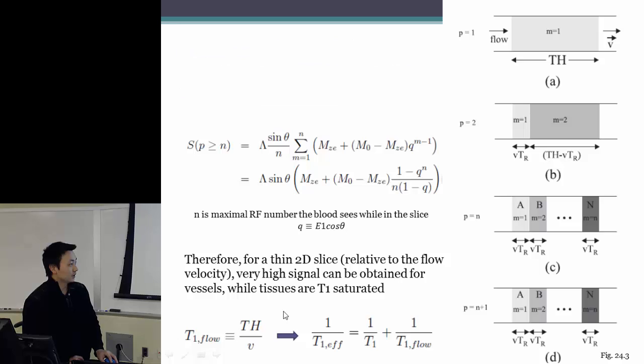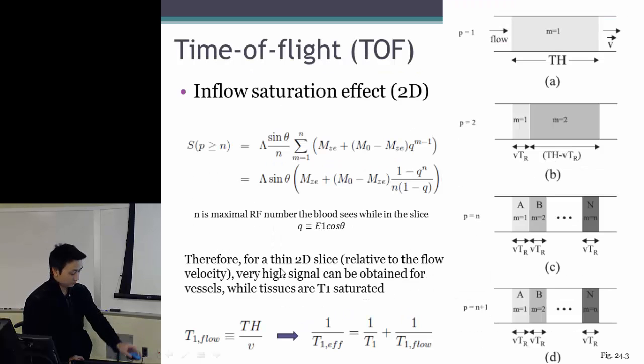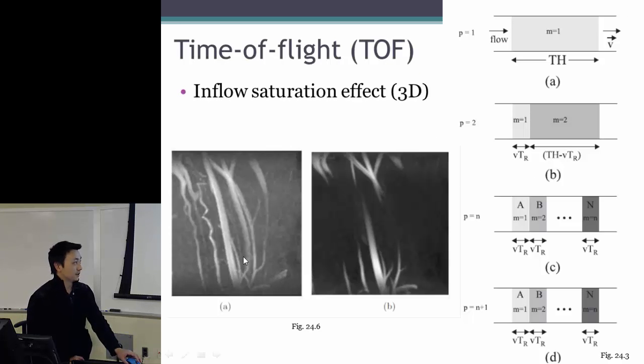So here is an example. I think this is the contrast enhanced one, showing the vessels that we should expect.